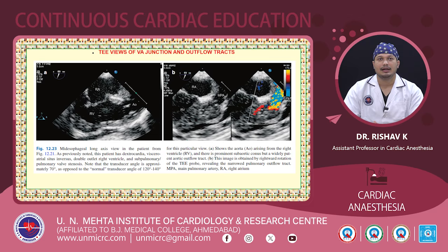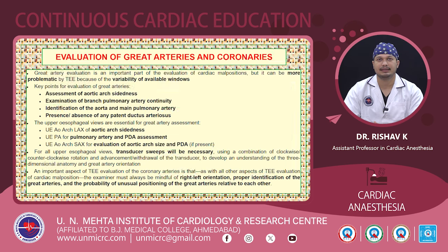the patient which is having dextrocardia, visceroatrial situs inversus, DORV, subpulmonary pulmonary valve stenosis. So as we can see, in most of the patients with heterotaxy and cardiac malposition, there will be multiple cardiac anomalies superimposed upon each other. So it is all the more important to adhere strictly to the sequential segmental examination and to proceed by using a structure based evaluation.